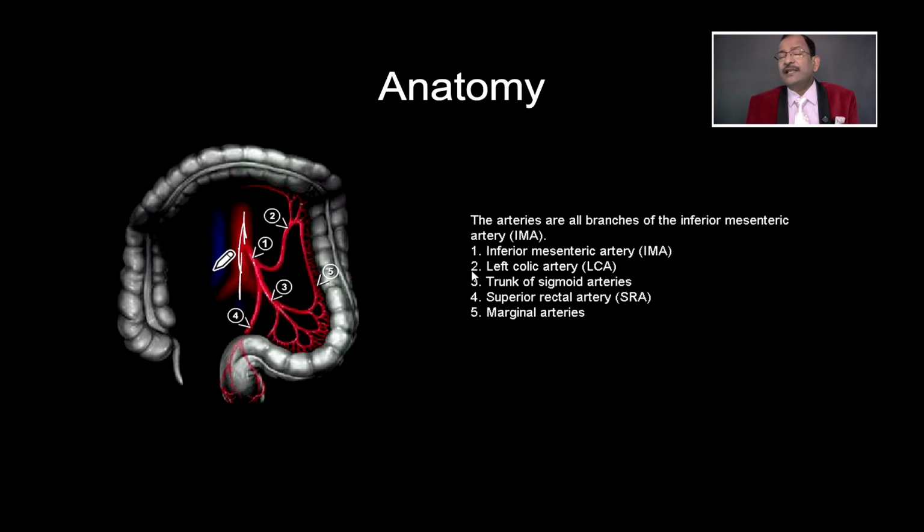The lateral approach for splenectomy is only done by the French. Otherwise, Americans and Asians, we do the inferior and medial approach first. So here also, in colorectal surgery for cancer, medial approach first. Because if you laterally mobilize it, all the colon will drop over the aorta. Then to dissect the great vessels of the inferior mesenteric, you have to pull it laterally and you will injure it. So the left colic you will spare, and the main trunk you will clip.